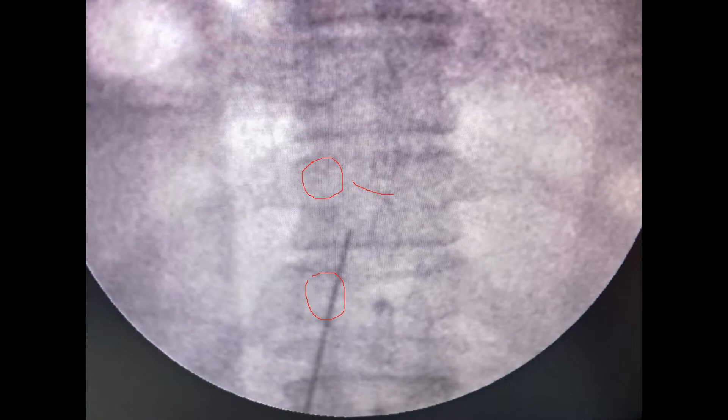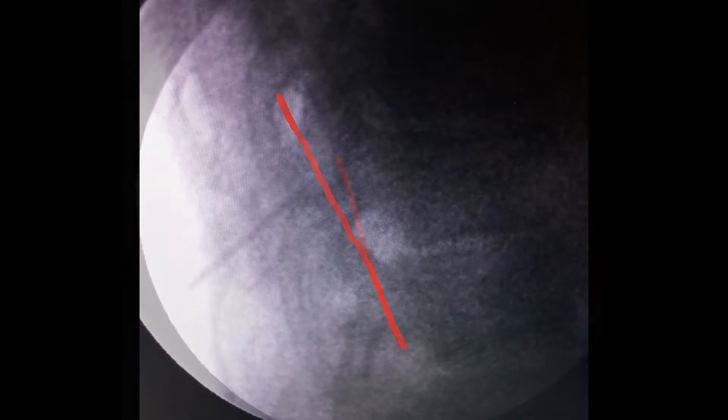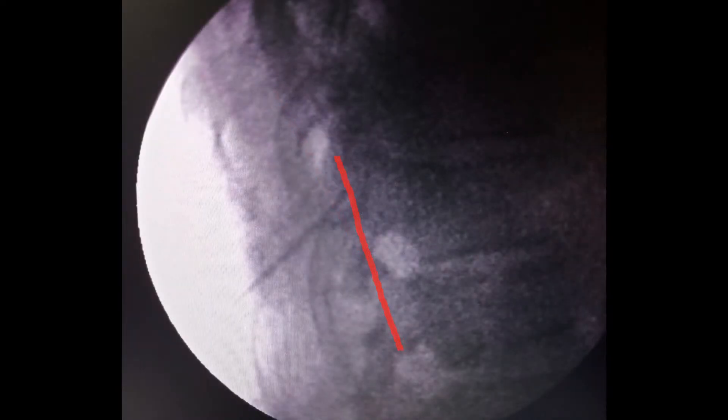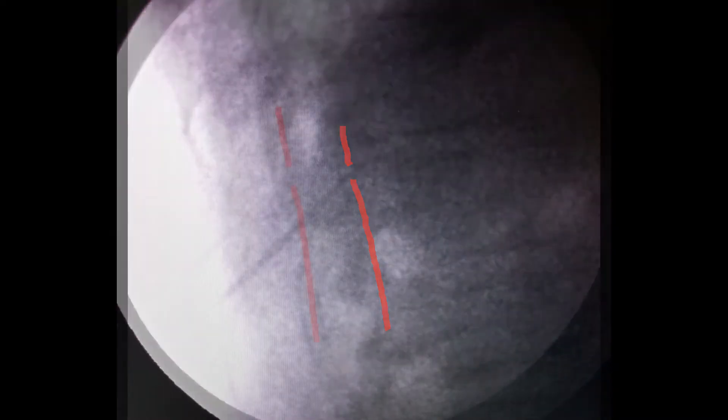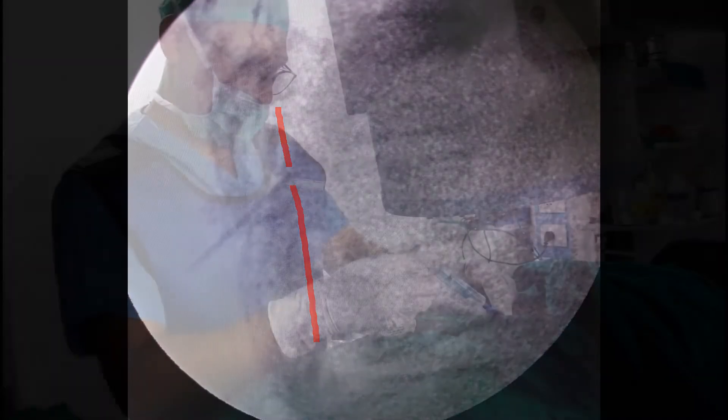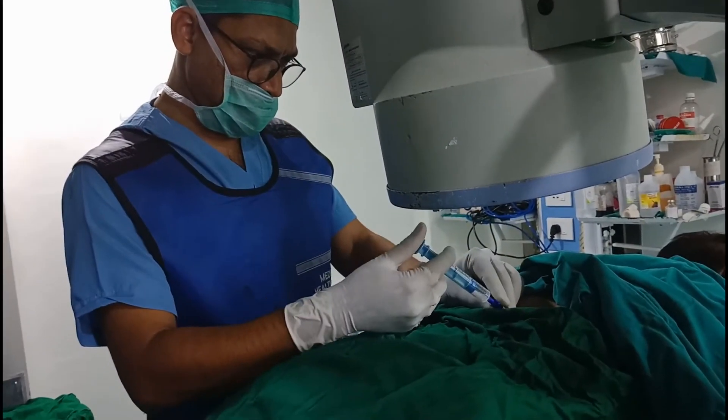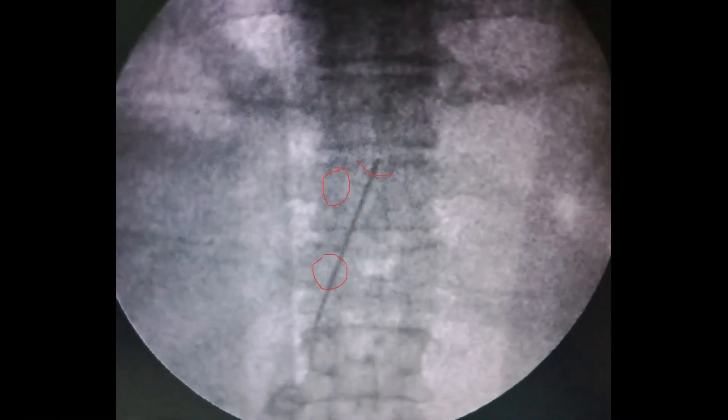Once it is hitting the upper border of the lamina, take the image in lateral view. The red line is showing the ligamentum flavum, so in lateral view the needle is advancing towards the ligamentum flavum. Once it is piercing the ligamentum flavum, confirm it by the loss of resistance technique. In AP view, the needle tip has gone past the upper border of the lamina.